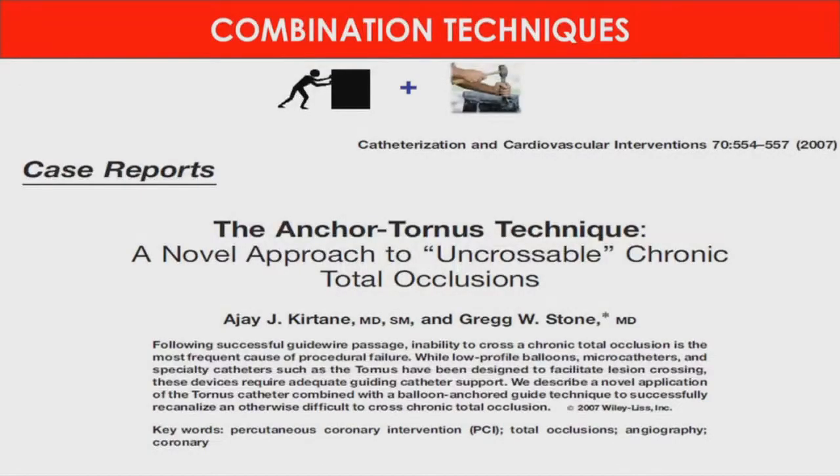Sometimes you can use a combination of these two techniques also. IJCTO had reported in this paper where they had used the anchor balloon technique and the Tornus to cross over the wire. So a combination of these two techniques can also help to cross the wire.